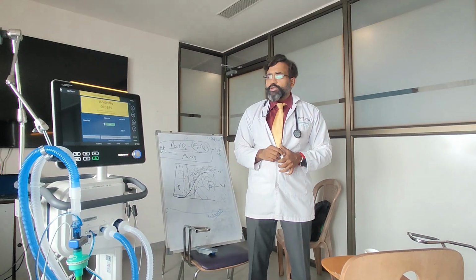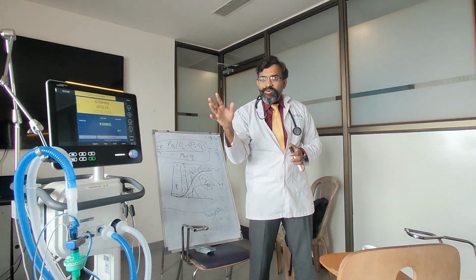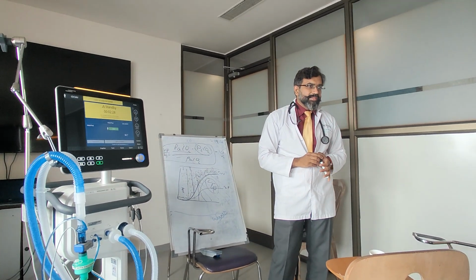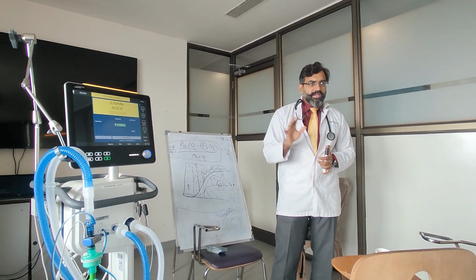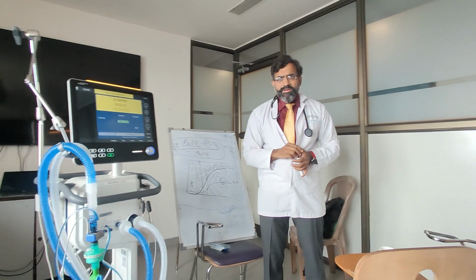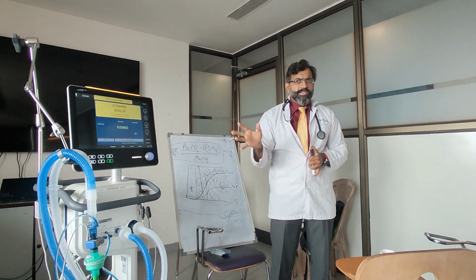So this moves from a situation where we touch the ventilator so many times to a situation where everything is done by the machine. So that's the beauty of ASV. Okay, understood this much till now? Are there any other systems like that? So now we've understood that this is doing something like this.